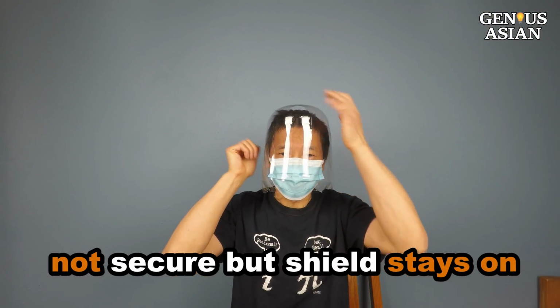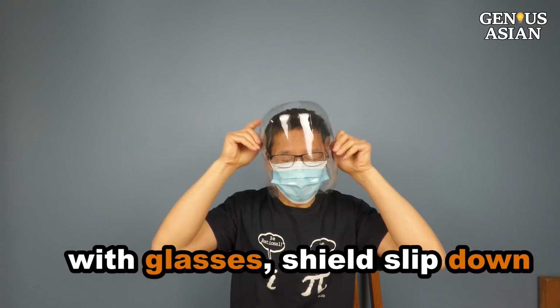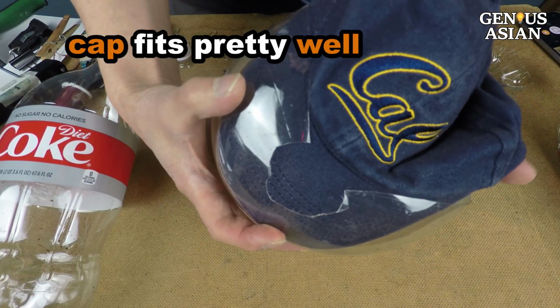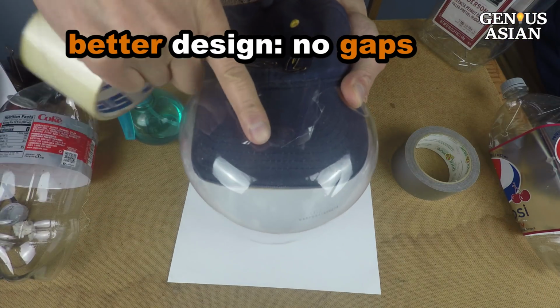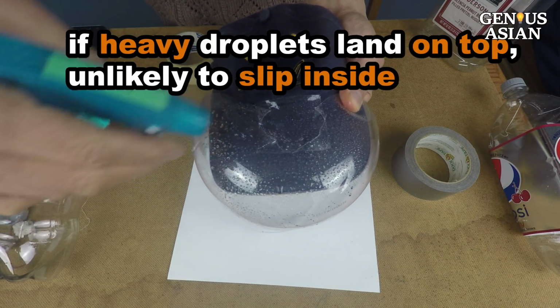Now I can put the shield on directly. It is not very secure, but it stays on. However, if I wear glasses, the shield will slip down. If I attach the shield to a cap like this, see? It fits pretty well. This design is better because on the top, it does not have gaps. If heavy droplets containing germs land on top, they are unlikely to slip inside.